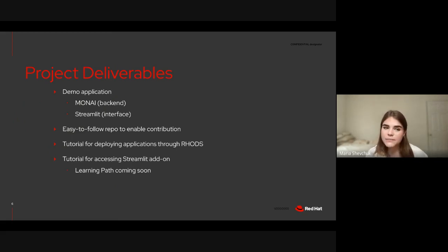For my project, my main deliverable has been a demo application where MONAI acts as a framework in the backend, and then I use Streamlit as a web UI developing tool.